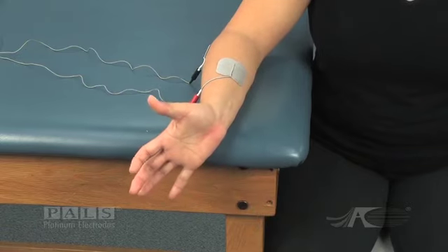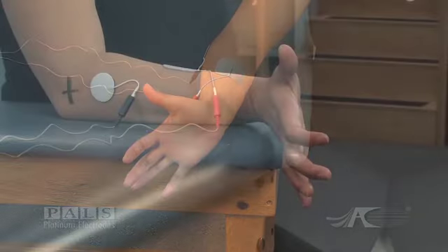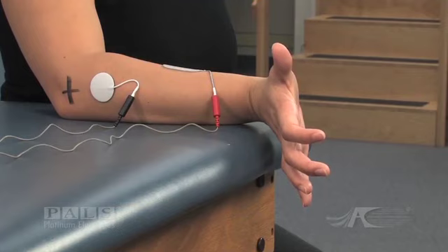The stimulated contraction is one of supination combined with fairly strong wrist and finger extension. The supinated contraction would be graded 3 out of 5.